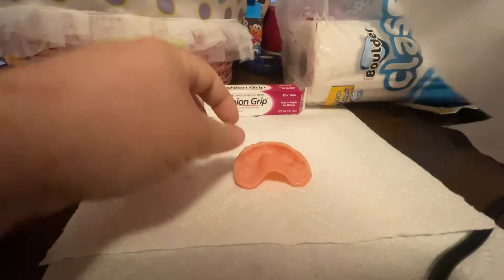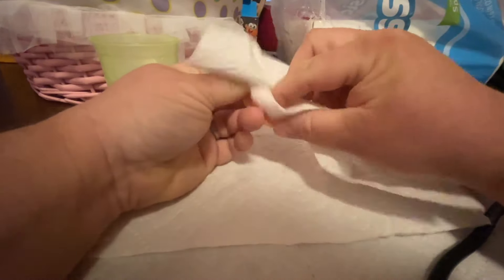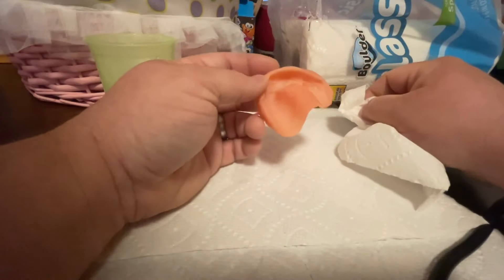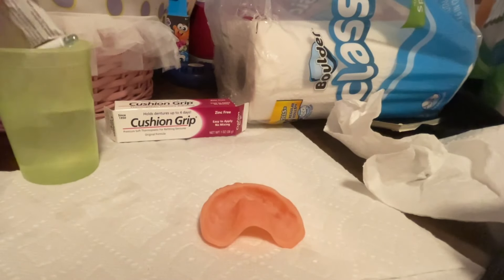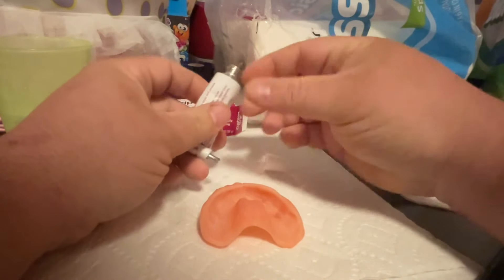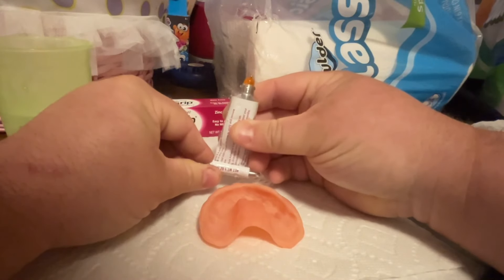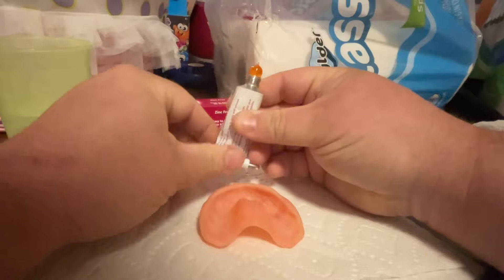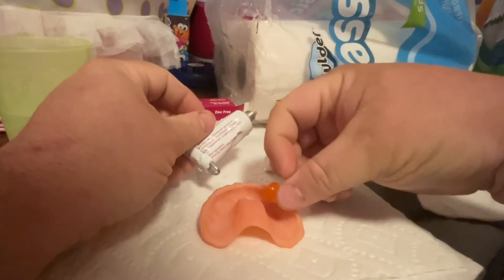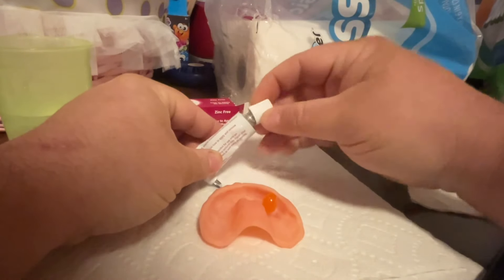The first step is to clean and dry the denture completely. While that is happening, you should have the cushion grip tube and a cup of very hot water. It needs to be in the hot water for five minutes to soften. Then remove the tube from the water, take off the cap with the key, and squeeze out about a marble-size amount of the cushion grip material onto your denture, then reapply the cap.